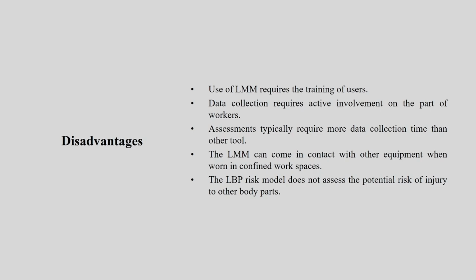So LMM can come in contact with other equipment when worn in a confined workspace. So then maybe it is disturbing or maybe problematic for the workers. The low back pain risk model does not assess the potential risk of injury to other body parts. It only talks about the lumbar portion of your back. Okay, so these are the disadvantages.